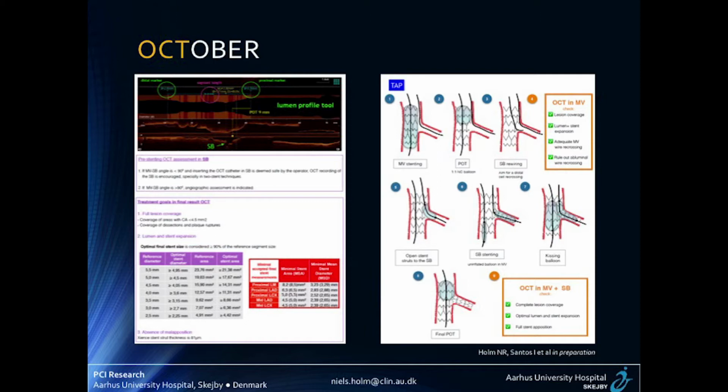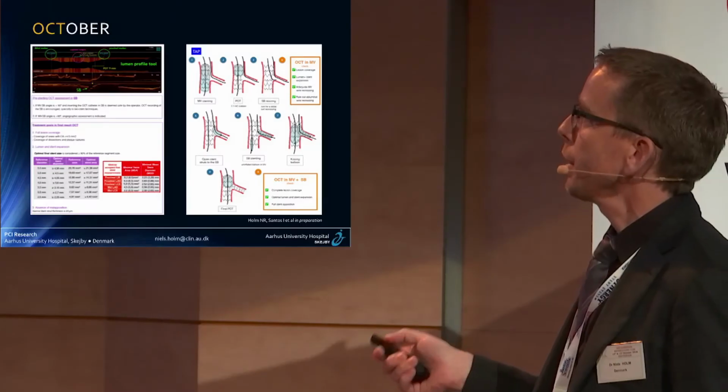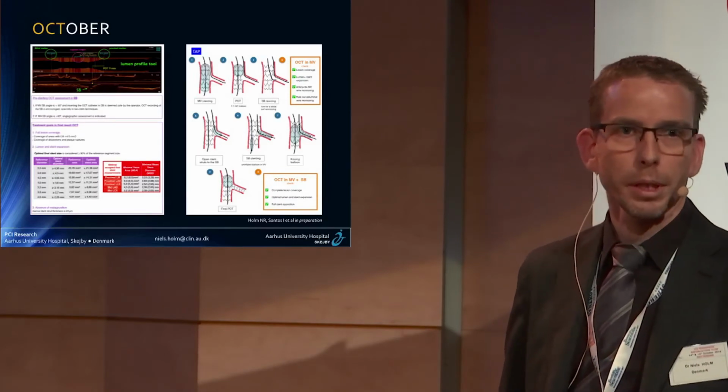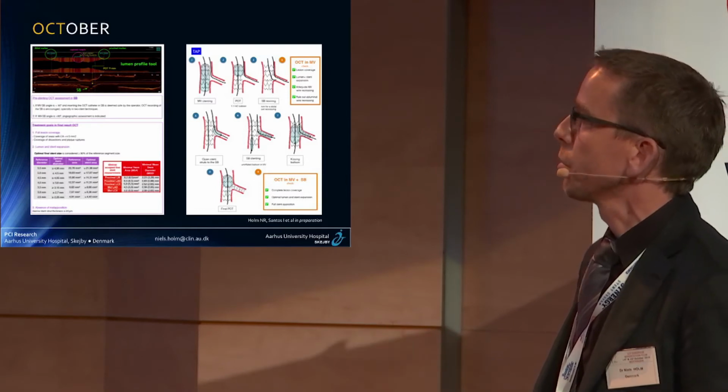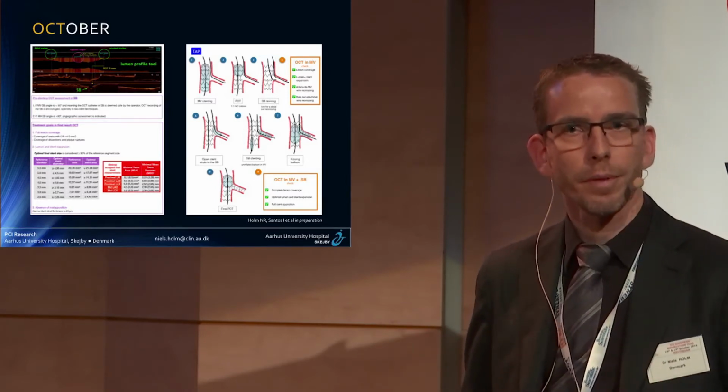What are the treatment goals? And this is an example from the TAP technique. Then you can just grab this paper and have it in your cath lab, and you can follow this, and you can see the checkpoints. So you can just tick it off that I have evaluated this.